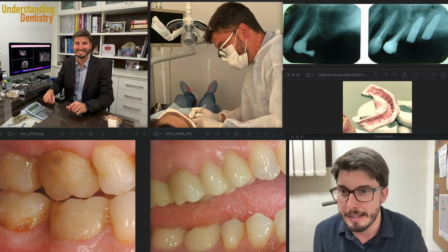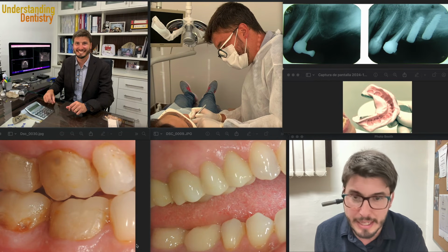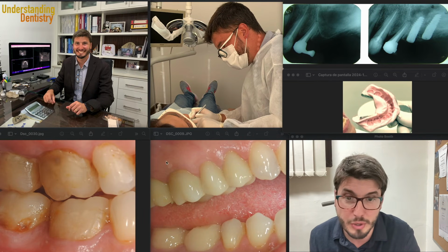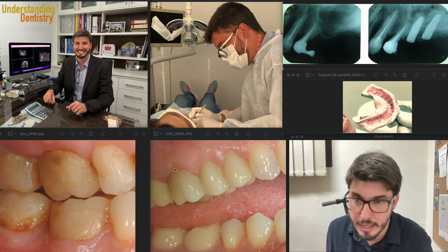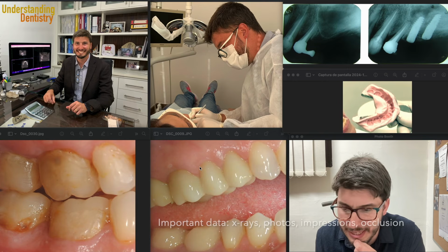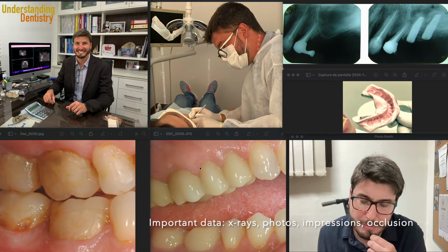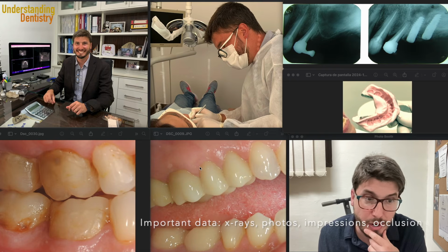All right. And then clinical intraoral photographs, you can also do that, because when you have the final situation of the case, you can show the patient the difference between the initial and final clinical situations. I'm just showing this case because this was the case of one of the last videos. Do take a look at this entire case, because there are also the radiographic images, and it's a nice case to show all the steps of a rehabilitation with dental crowns.